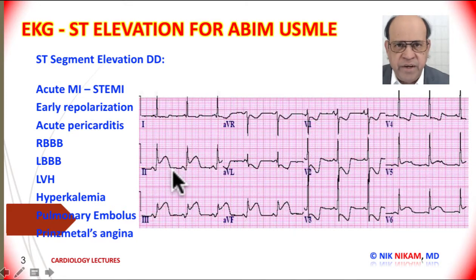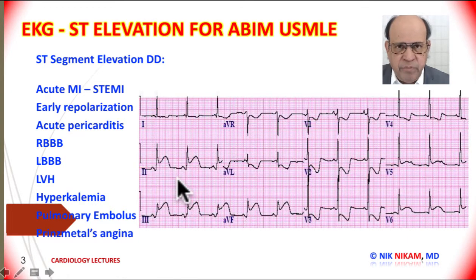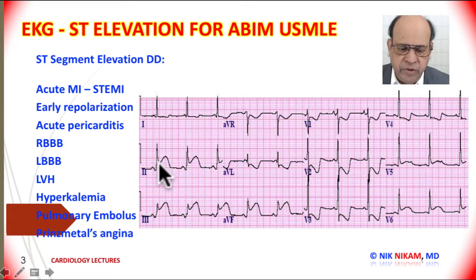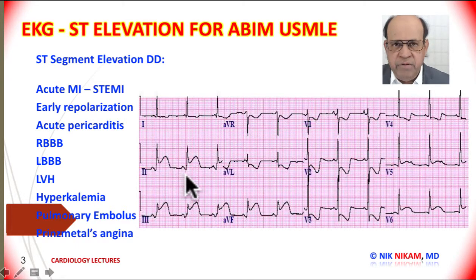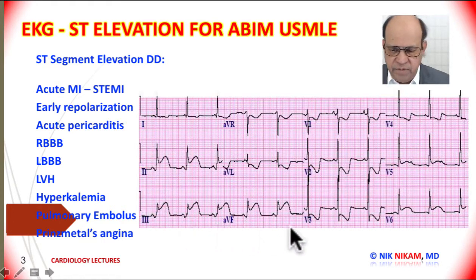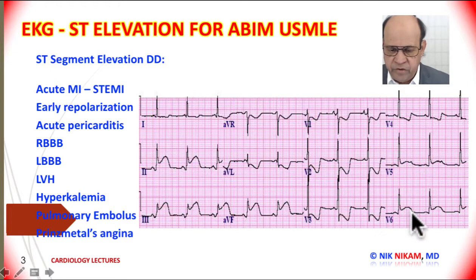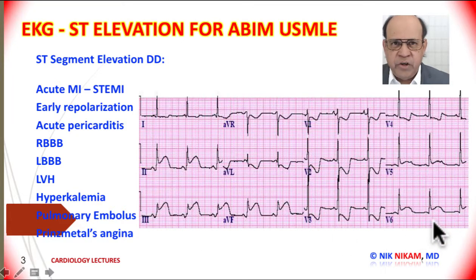The ST segment is lifted almost 3 to 4 mm and it imperceptibly blends with the upstroke of the T wave. This is characteristic of an acute myocardial infarction. In an acute MI, the ST segment elevation goes straight up and blends with the upstroke of the T wave. We see ST elevation in leads 2, 3, AVF, and to a certain degree in V5 and V6. This represents an inferolateral acute myocardial infarction, or STEMI.